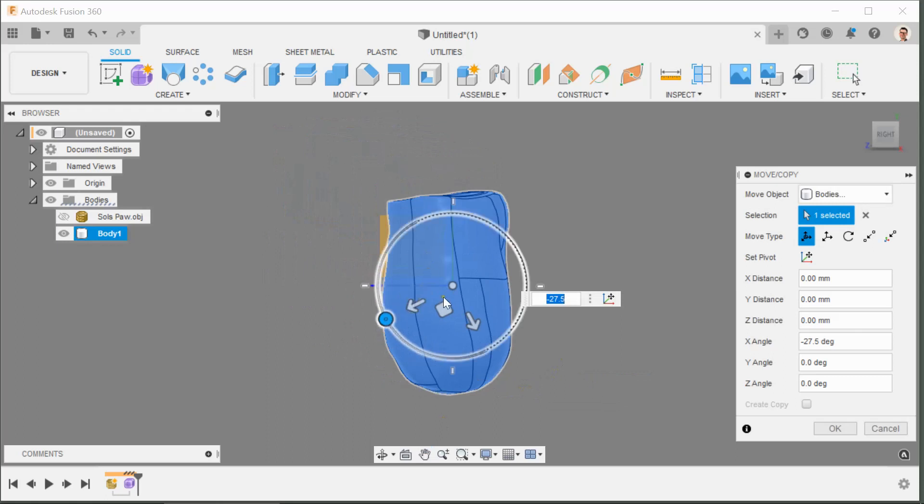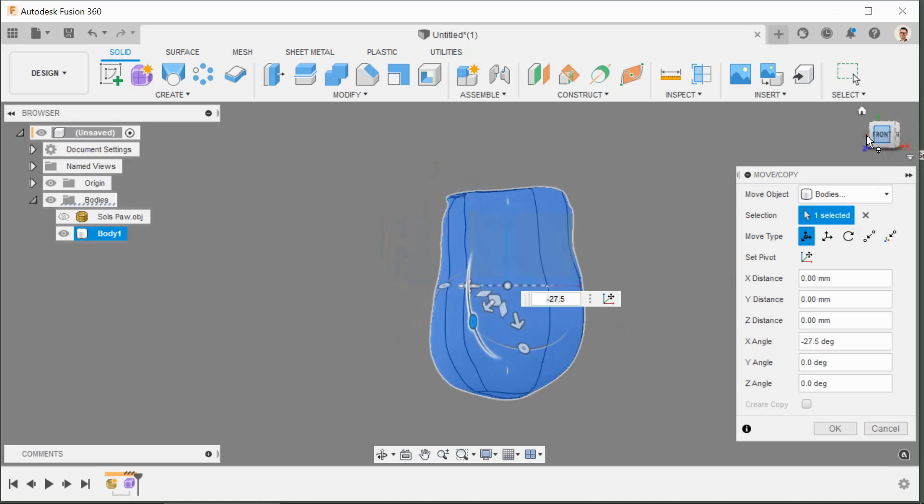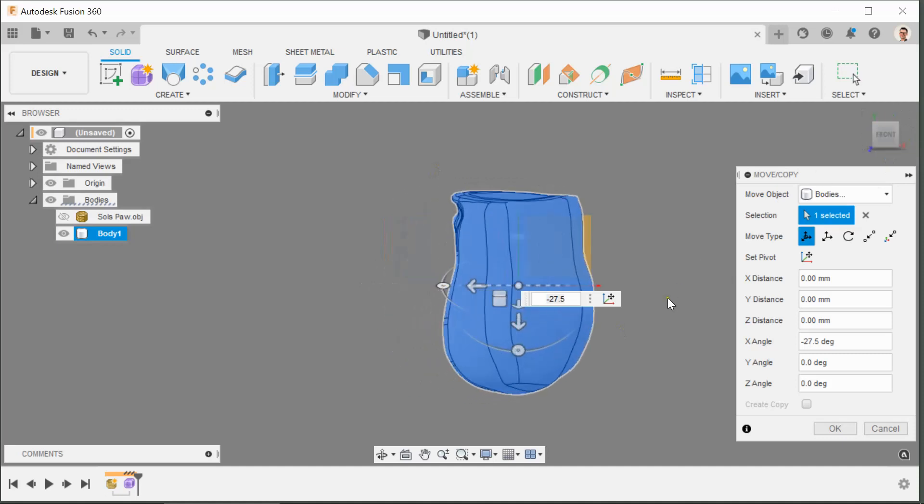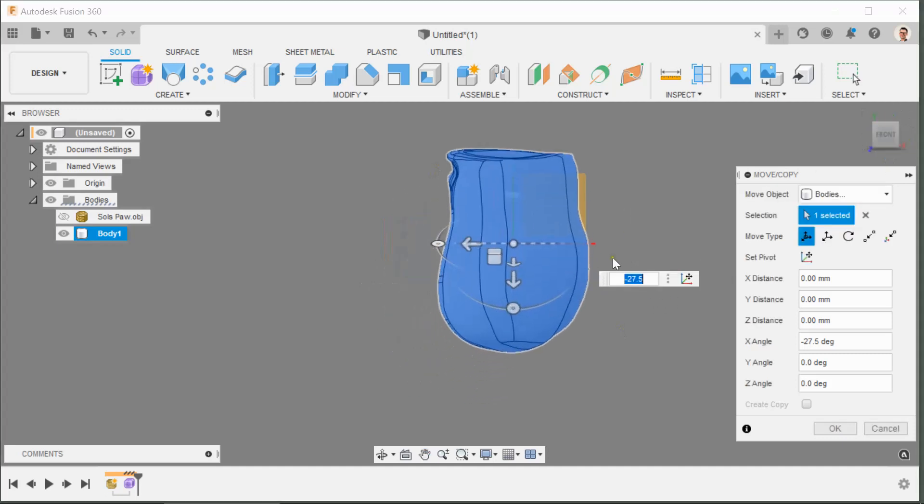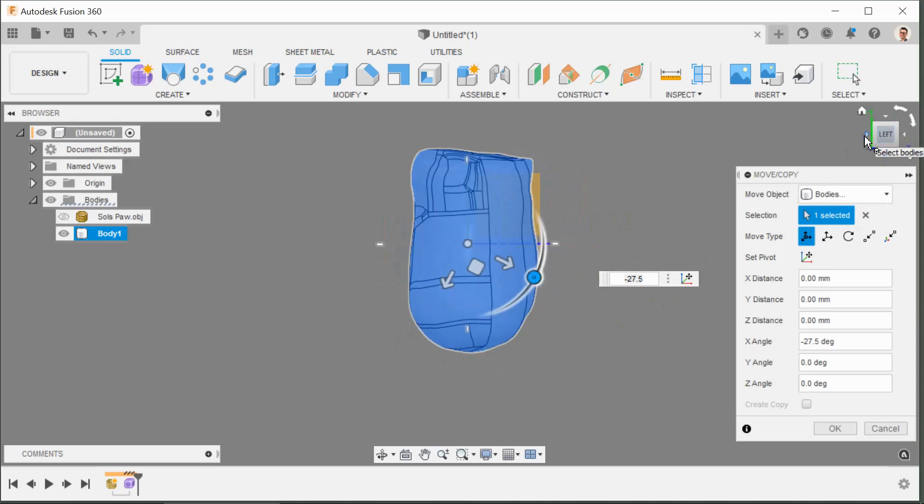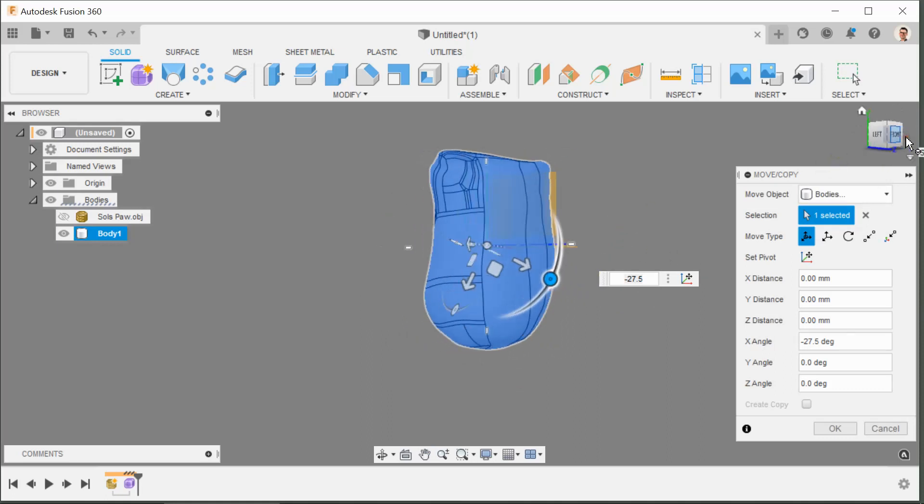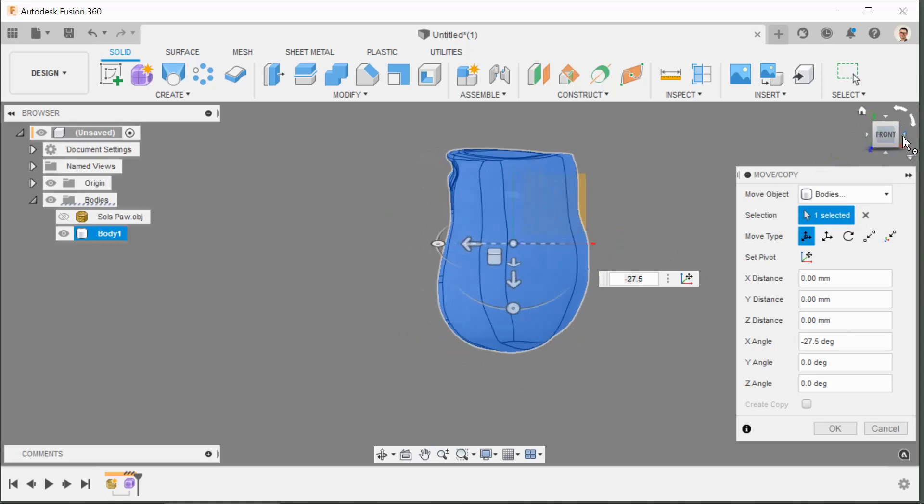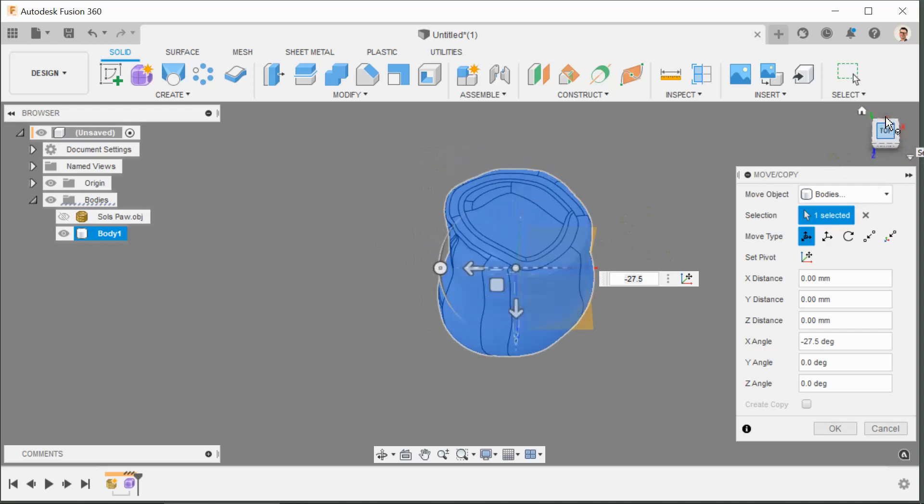Using the NaviCube again, click on the arrow to look at the front. That looks kind of right, but as I know Sol's geometry really really well, I know that it's actually turning in slightly. So that's aligned left and right. What we can do now is look down from the top.